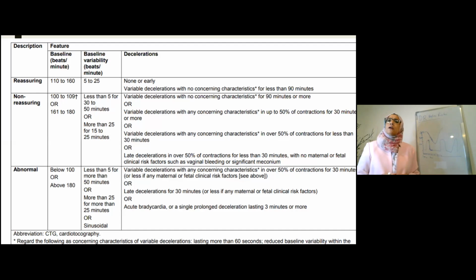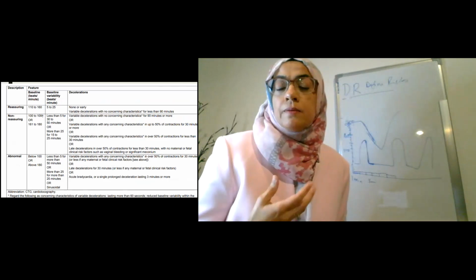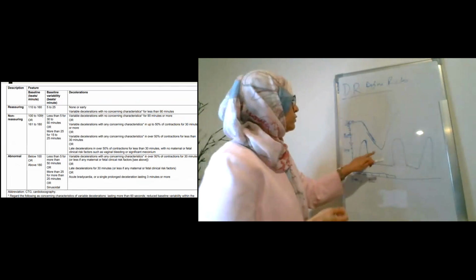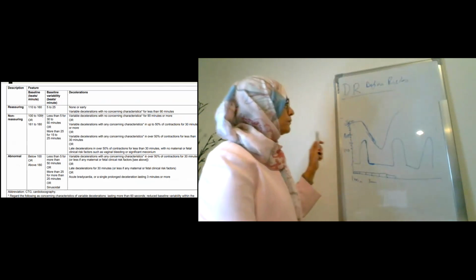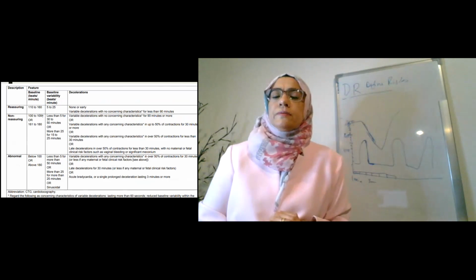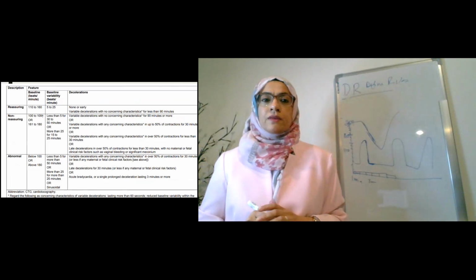We are saying, why isn't it picking itself up very quickly? Is it getting tired with the stress of the labor? So we don't like these. We call them late decelerations. So this is the easy part. Any questions so far? No, there are no questions in the chat box, so I think you're okay to continue.